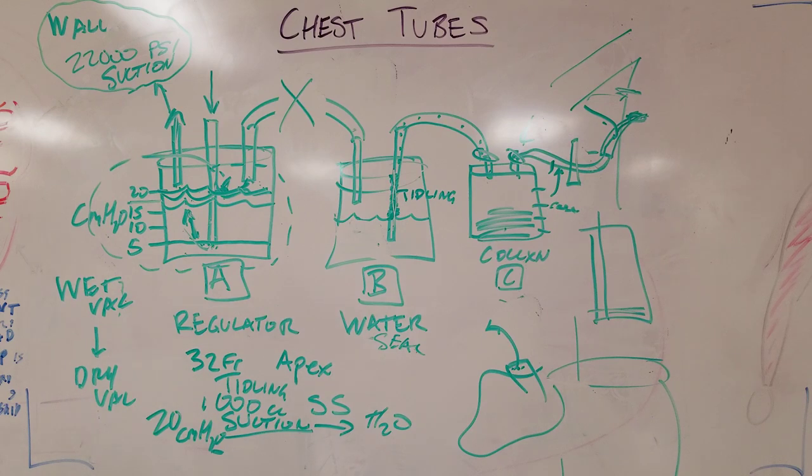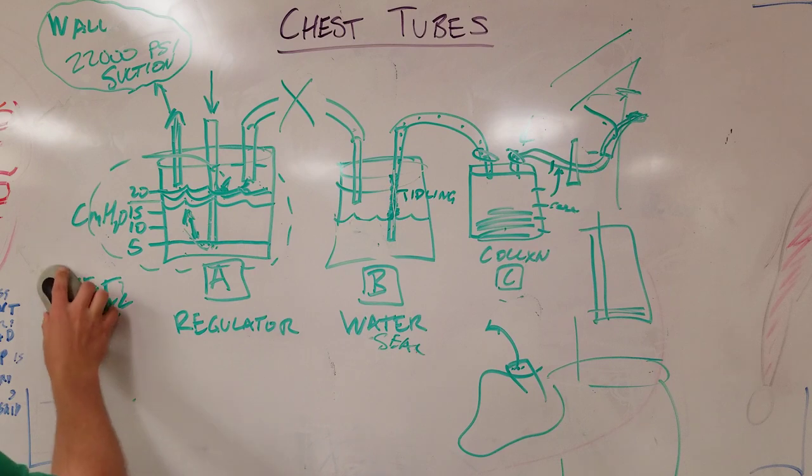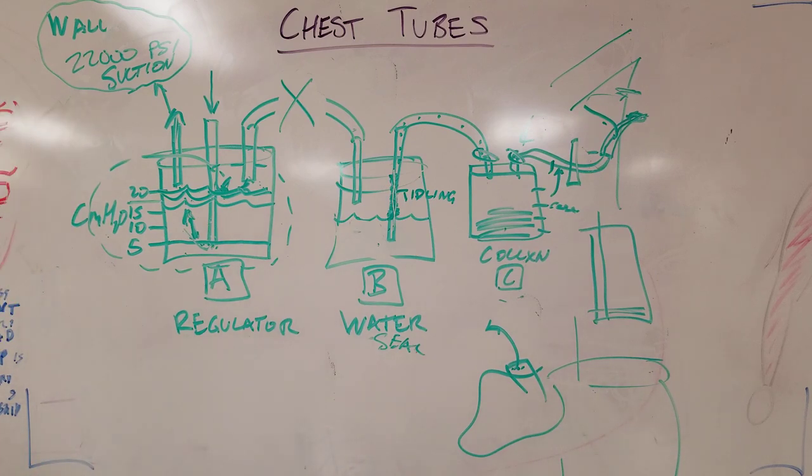And then lastly, sometimes people say, hey, how do I know when I can pull a chest tube, when I should recommend pulling a chest tube? And there's a couple different ways. You know, you want the patient to be hemodynamically normal and stable. You want all of their admission injuries to be either treated or et cetera. But the big thing that people talk about is what volume. And I would say most people agree that when a chest tube is putting out less than 100 to 150 cc's of fluid per day, that chest tube can come out.